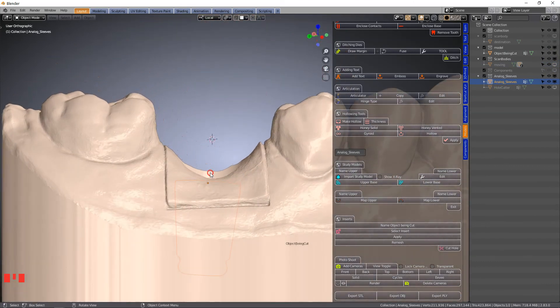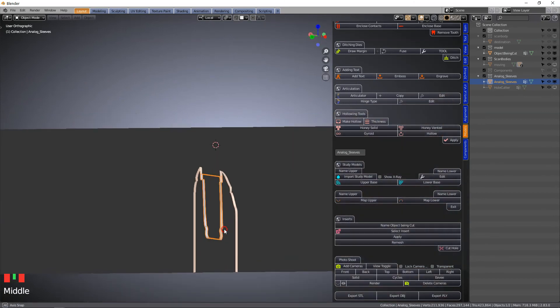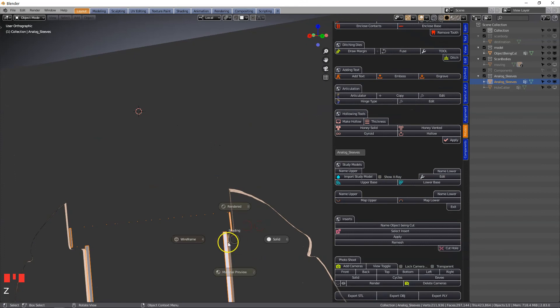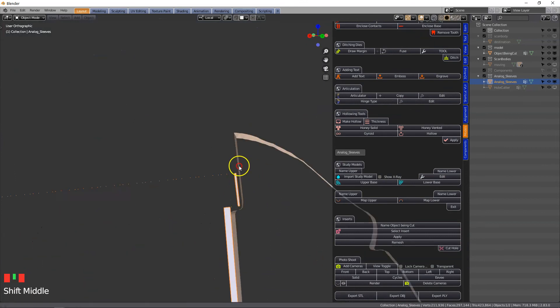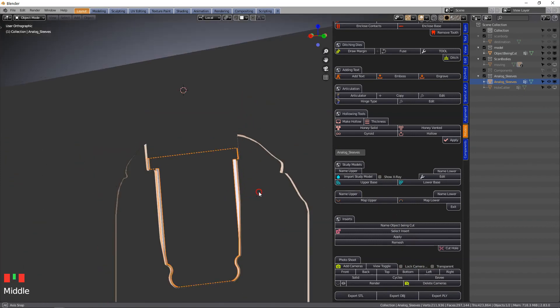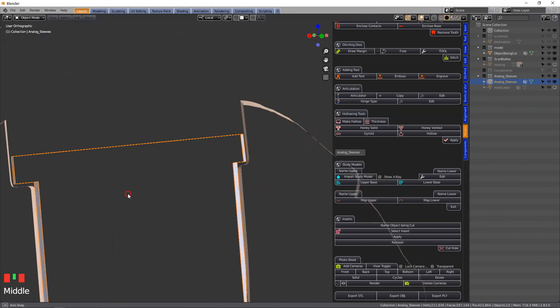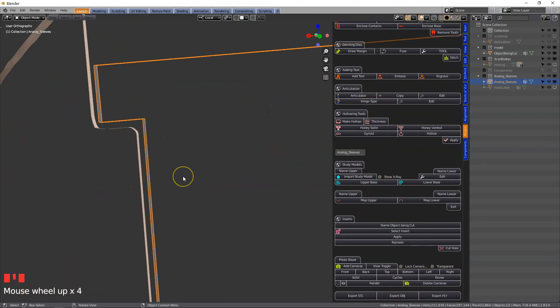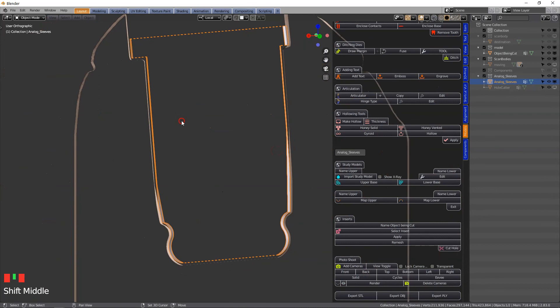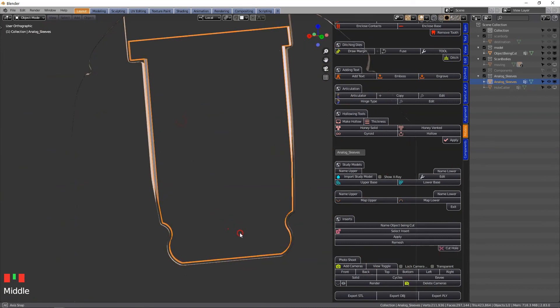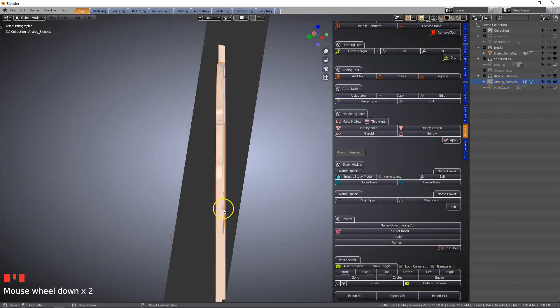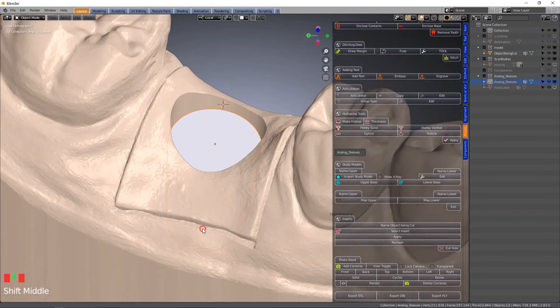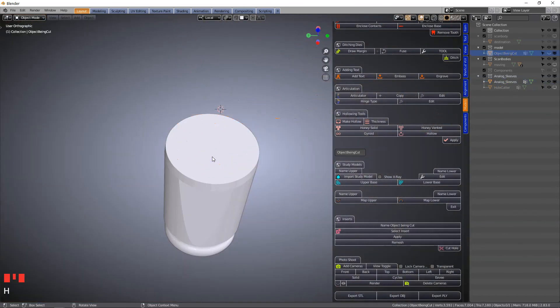In a cross section we're going to view this in cross section. We can see that we've got a 0.1 millimeter little gap, an offset gap, to put our analog into the model. Alt B to exit. Then you may just print this model.